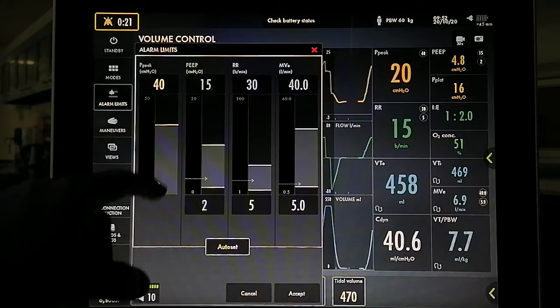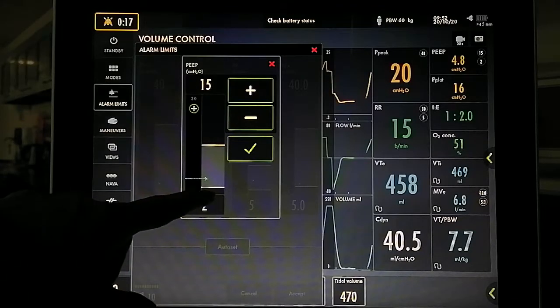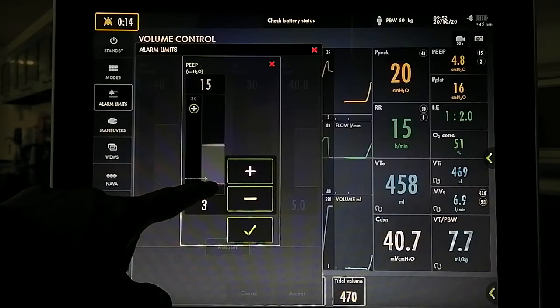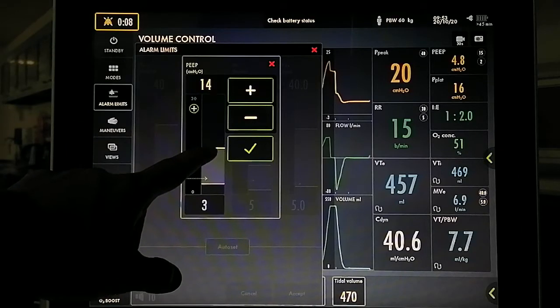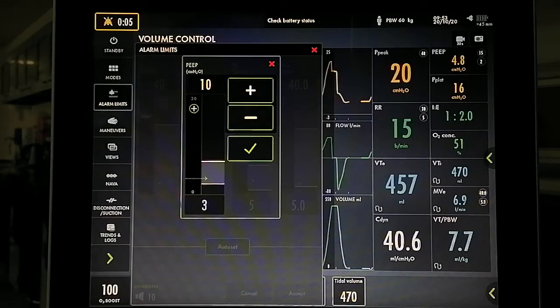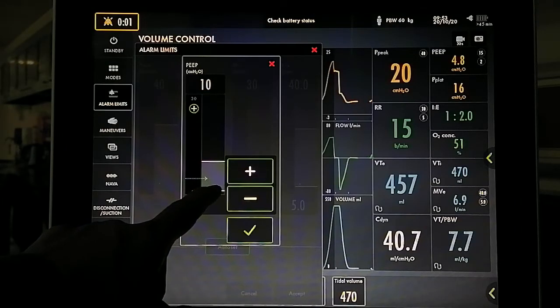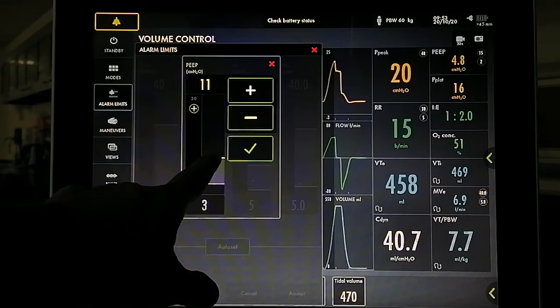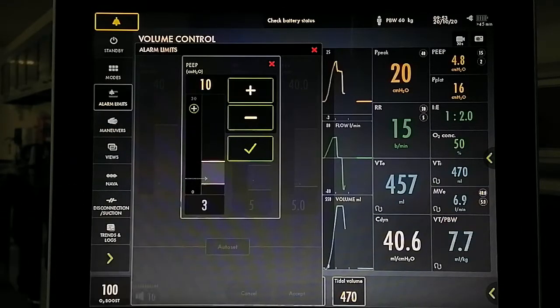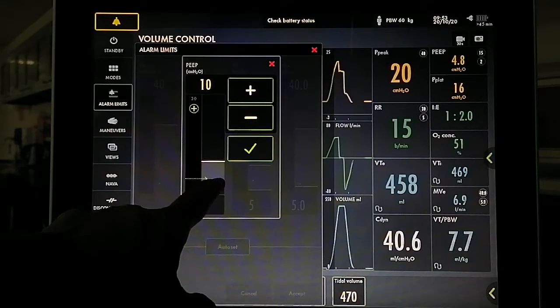Check. And then when you go to the PEEP alarm, the presence of the two bars suggests that you have a low PEEP alarm limit and a high PEEP alarm limit. Again, you can use the guideline from your manual to change the setting. Remember our PEEP is 5, which is signified by the broken arrow.